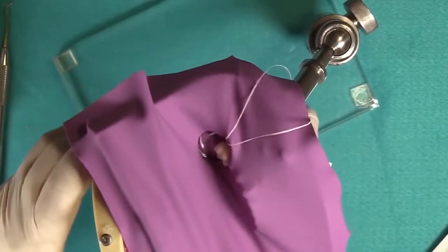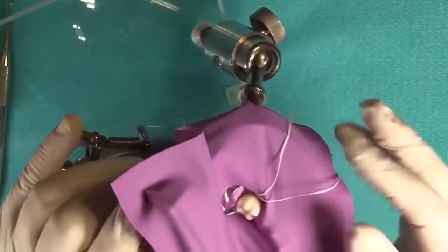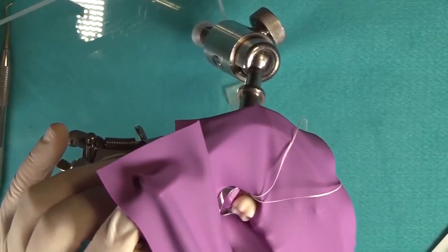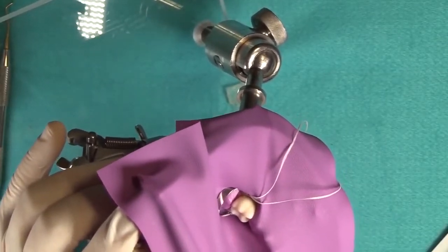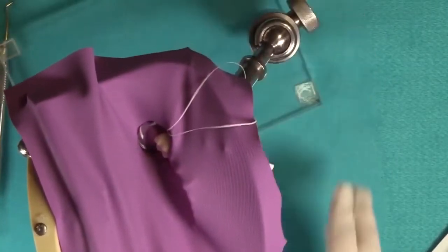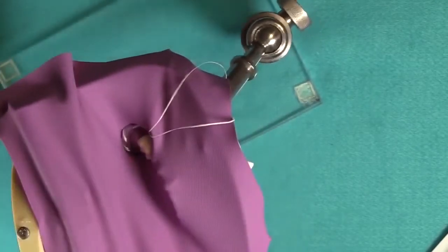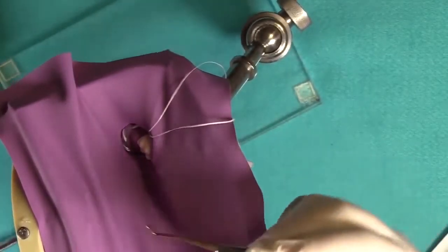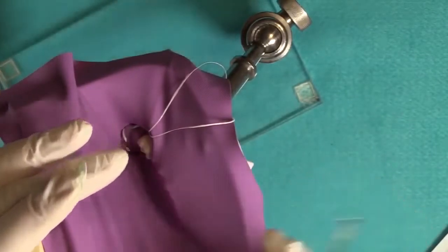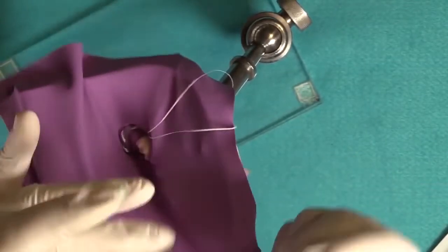And so, now we're not quite done yet. What we have to do, I don't know if you can see, the wings are still underneath the dental dam. If you left this in this manner, saliva would come up through the holes. So what we have to do next is we're going to take our beaver tail instrument, our composite instrument, whatever you want to call it. Now, there are 2 ends to the instrument. One I call a beaver tail end, and the other end I call a check mark end.